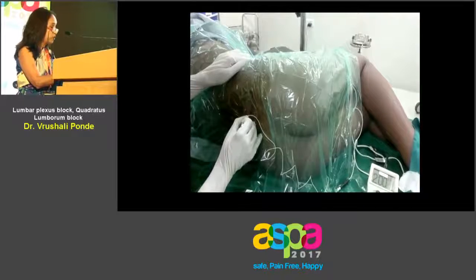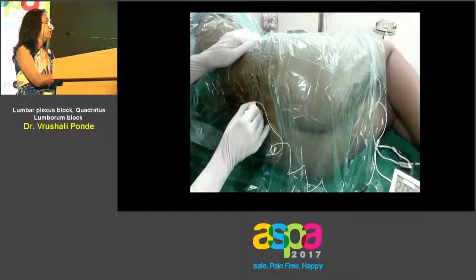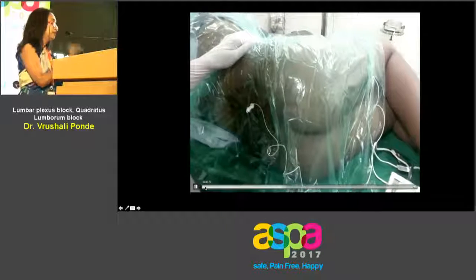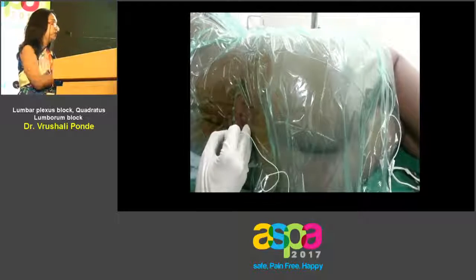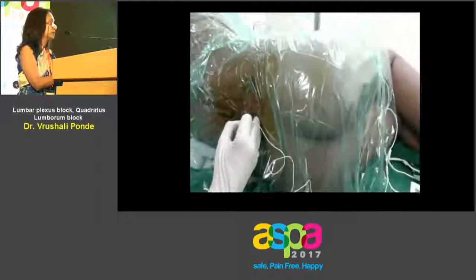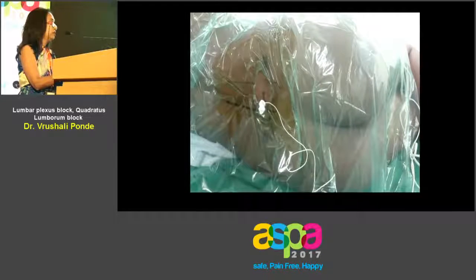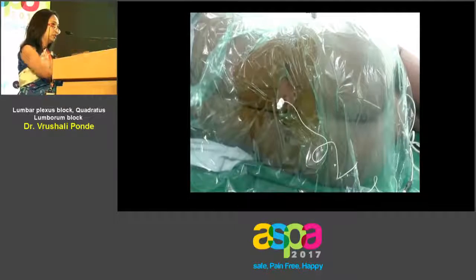So we know which to ignore and which not to ignore. We need to all the time be attentive of the depth at which we are working. There needs to be a very fine-tuning of the current going on and the fine-tuning of the needle tip as well. This other response is one which I wouldn't like to consider because this is a deep response.